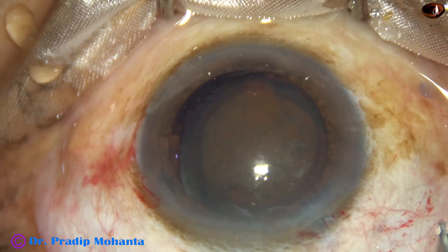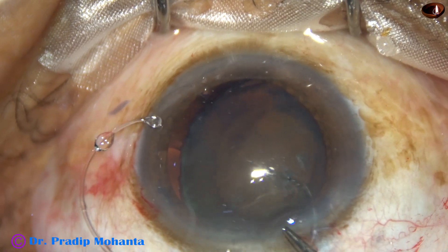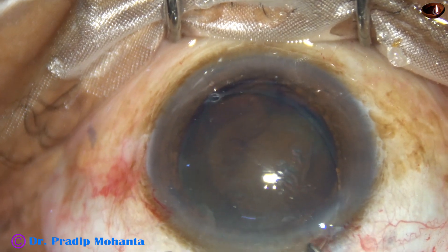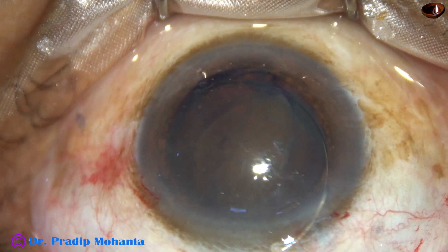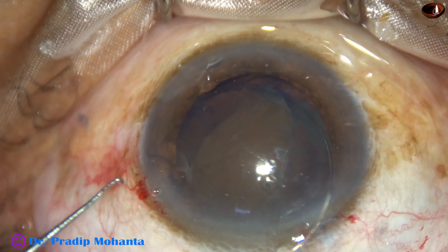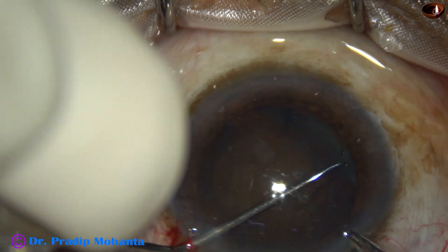Hydrodissection is done, and then the capsular tension ring is applied. With the help of a McPherson's forceps and a tooth forceps, the capsular tension ring has been introduced from the main incision, and as I come to the trailing end, I use a McPherson's forceps and a Sinsky hook to place the CTR at the equator of the capsular bag.